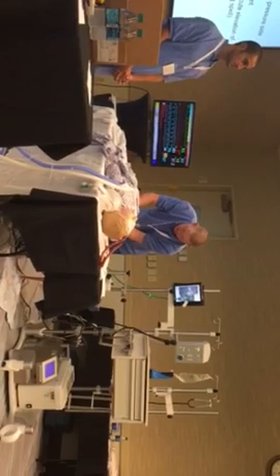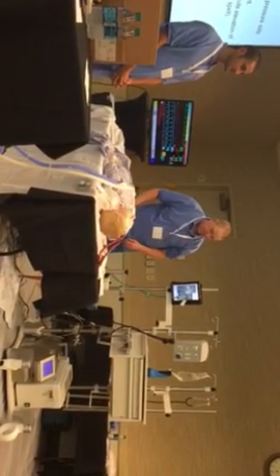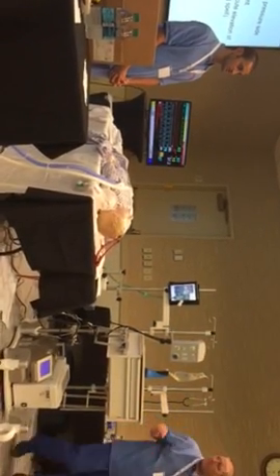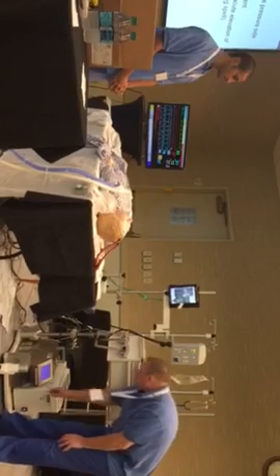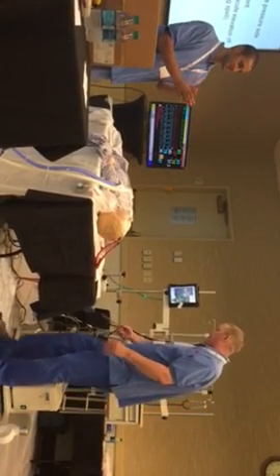Yeah, on the venous side. Good. Location, right? Where's it from? What side is it on, and also what configuration of ECMO are you on? Because that changes potential risks associated with it. So where is air, I don't want to say safe, so where is air safer?